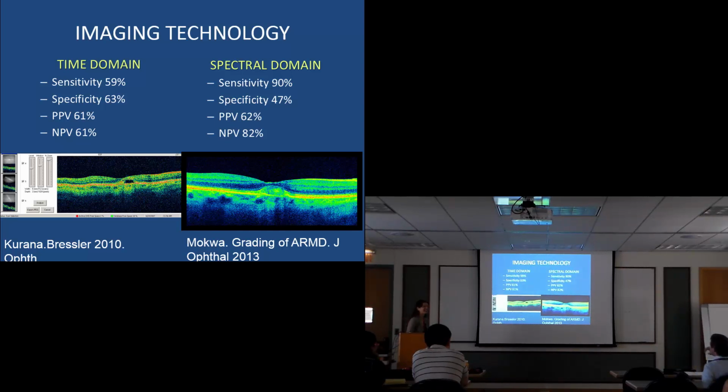So, okay. Why do you think the specificity fell? Is it because of more false positives? In the spectral domain, I do think that is the case because a lot of diseases look the same, and so it's still hard for us, especially when it comes to hemorrhage. That's something, color-wise, looking at the fundus photos, we're really good at analyzing, but when it comes to the OCT, the hemorrhage can be laying right on the retina, very hyper-reflective material, and it's very confusing at that point. Is it hemorrhage? Is it exudate? Is it fibrous material? And it starts to look the same. So that's where specificity would be hard to roll in.